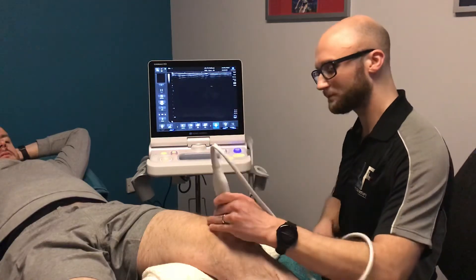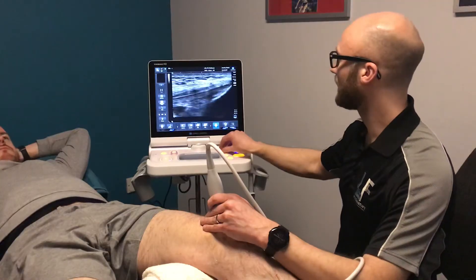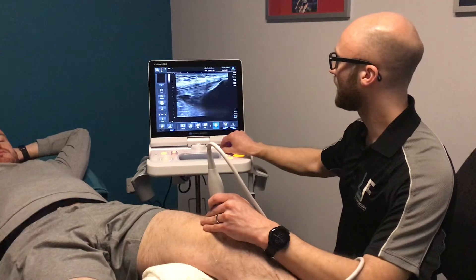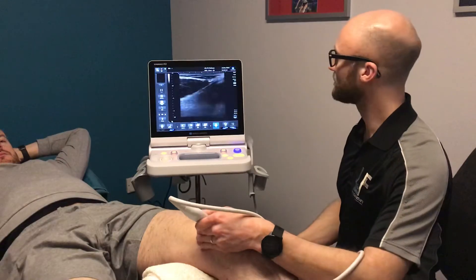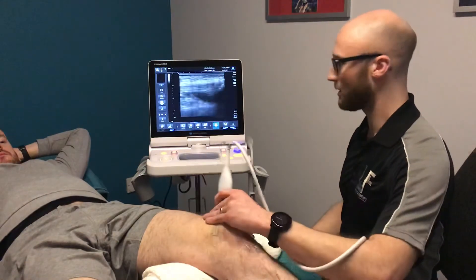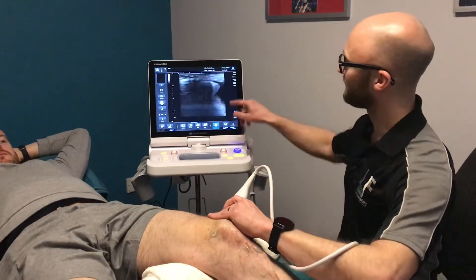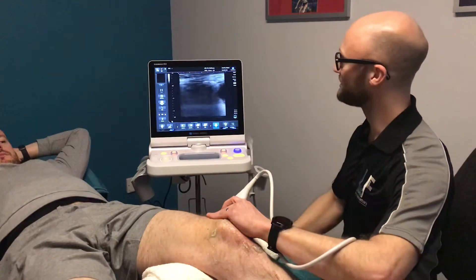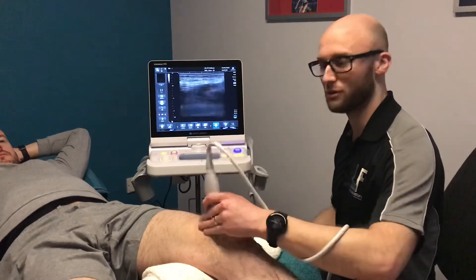If we come back up to the top and we're more interested in the joint itself, we can sweep round and see if there's any swelling around the sides — what's known as the medial recess or the lateral recess of the knee. Emmett's got a little bit of something interesting going on here so maybe he's been through the wars in the past, but he's fine at the moment.